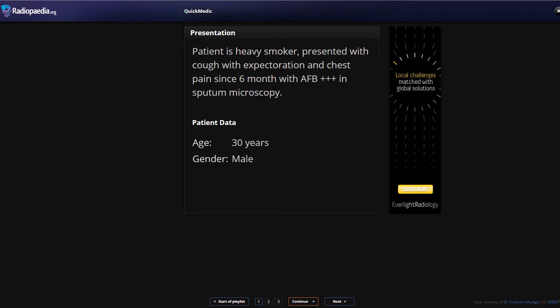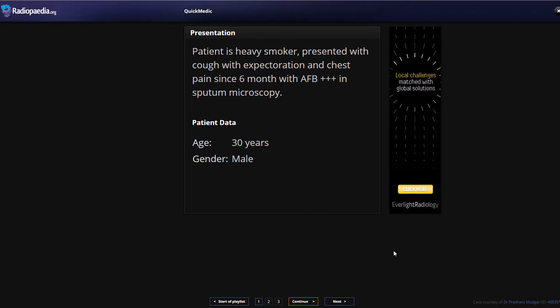We'll reference the respective Radiopaedia ID - check them out and thank them if you've got the time. So our first radiograph: the patient is a heavy smoker who presented with a cough with expectoration and chest pain for six months, with acid-fast bacilli positive in sputum microscopy. They're 30 years old. We can pretty much say they probably have tuberculosis given the AFB positive sputum microscopy.